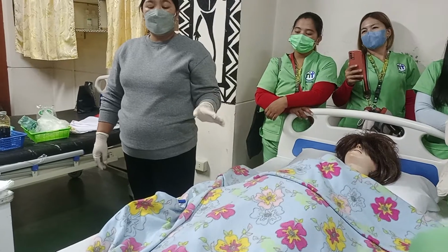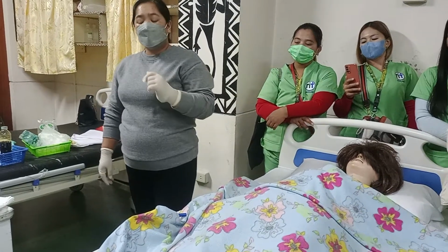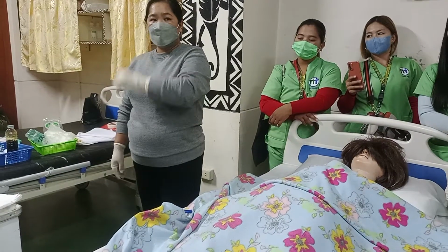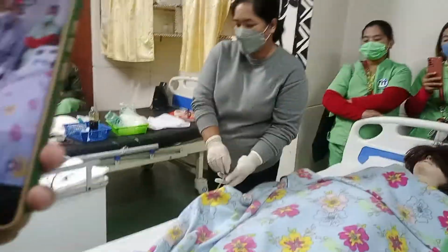Tapos, kapag sinabi na niyang naiihi siya, sabihin kay ma'am nurse or kay doc, ma'am, naiihi daw yung pasyente ko. Okay? Then sasabihin ni doc, okay, very good, pwede na. Remove the catheter. Then that's the time we remove the catheter. Okay? So there, positive na.